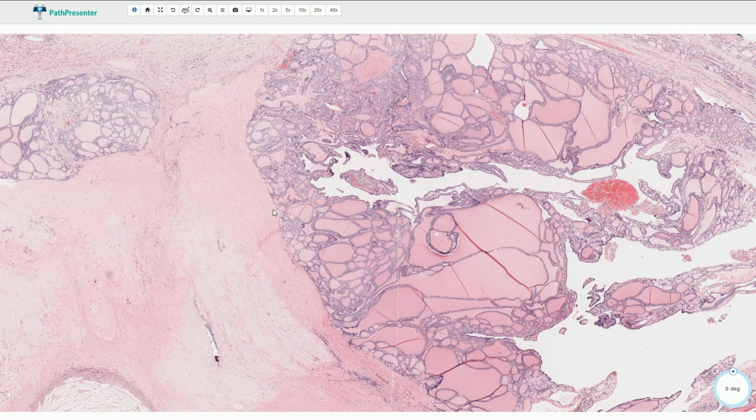The pathogenesis of at least some cases can be explained by impaired thyroid hormone production, which is then associated with increased secretion of TSH, and that drives the proliferation of the epithelium, and that leads to nodular transformation. Some of the thyrocytes are more responsive to the TSH, some of them are less responsive to the TSH. So that's why we see variable multiple nodules. Some of the adenomatoid nodules can even become TSH independent, and then they grow even without a TSH stimulation.